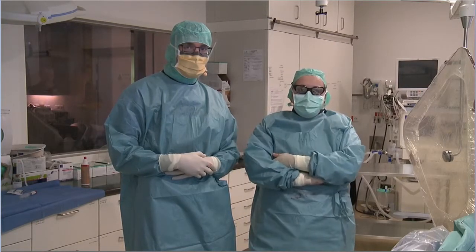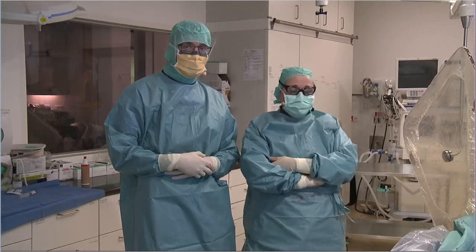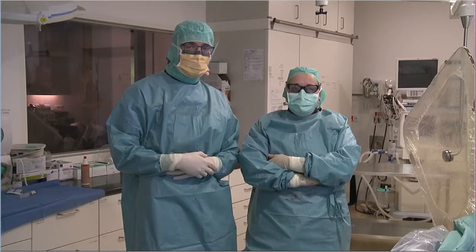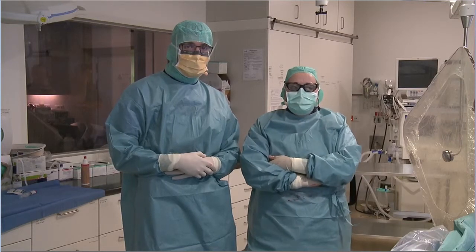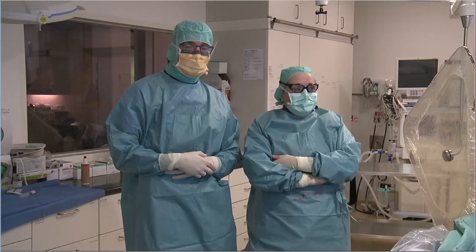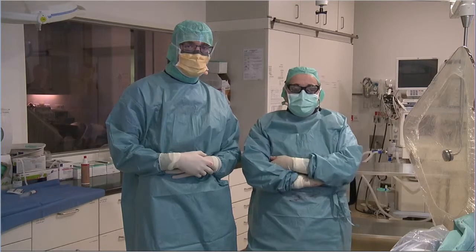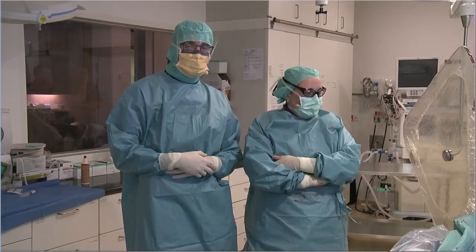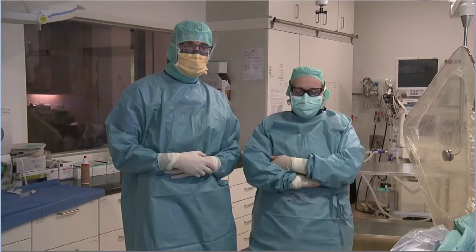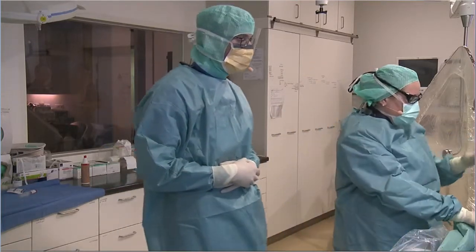This is a 54 years old patient with 3 liver lesions in liver segments 8, 5, and 6. Together we begin a chemoembolization of HCC lesions.